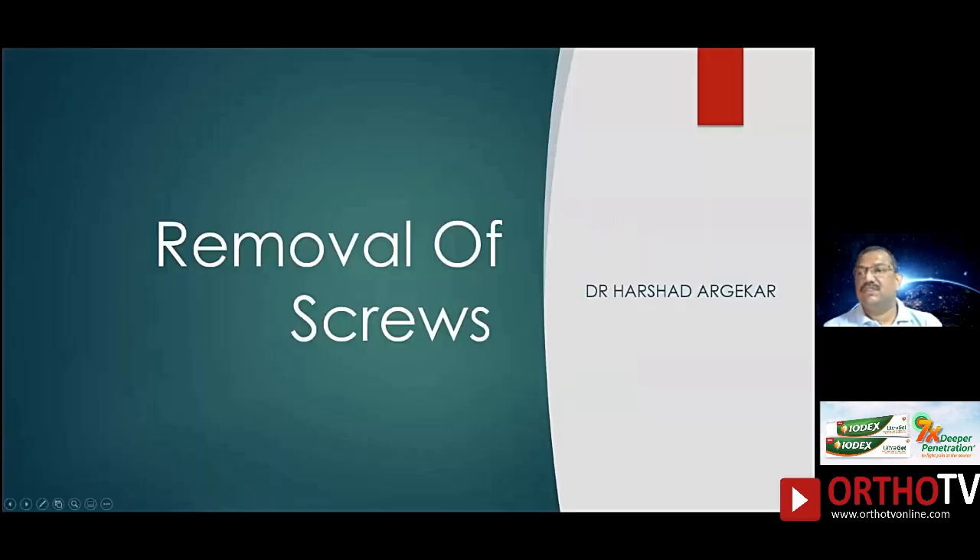This is a situation we encounter very commonly where screws are in the plate and for some reasons — because of technical problems — screws don't come out. This happens very commonly especially if you are removing an implant put by somebody else, or the implant has been put many years ago. Also if you have implants of standard quality, sometimes the head just shears off or breaks off, or in situations where there is implant failure the screws have broken off and you find it difficult to remove.